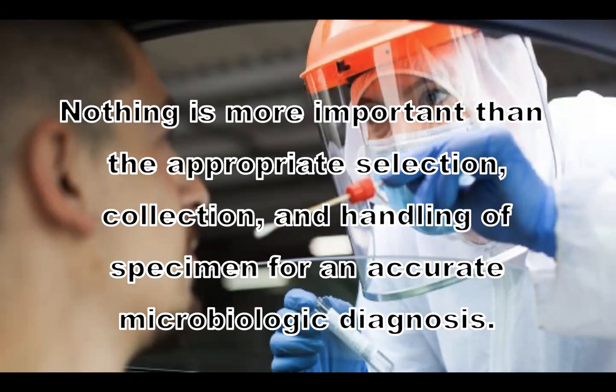We also process urine, CSF, stool, exudates and transudates, and then genitourinary specimen. Okay, so initially we do gram staining, we do smears, and then we culture them. For some cases, we do centrifugation. We work with the sediments like for CSF. For others, we directly inoculate them into our culture media.